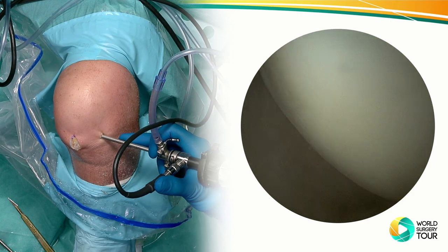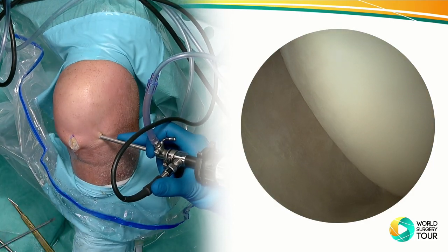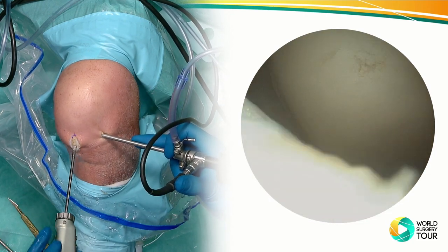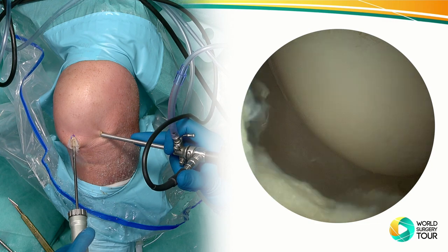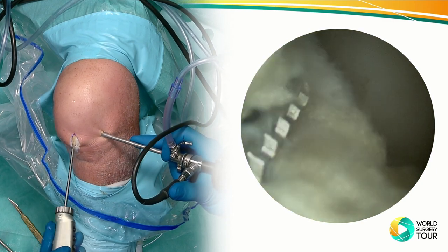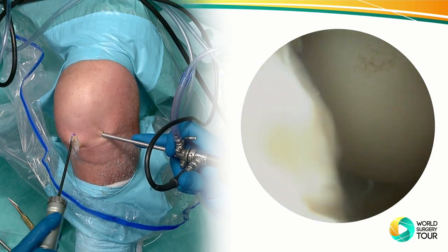I need to have a little more clean with the shaver. That's really important, to clean it up extremely well. And the positioning was perfect, I think, Sven. It looks really great. And now if we clean it up a little bit more, it should be easy to perform. So that's really a key step of the procedure.